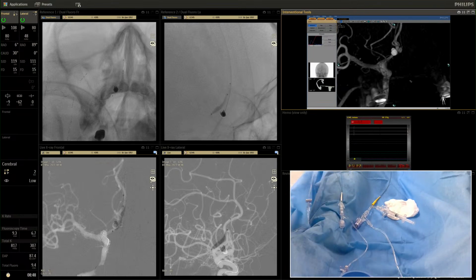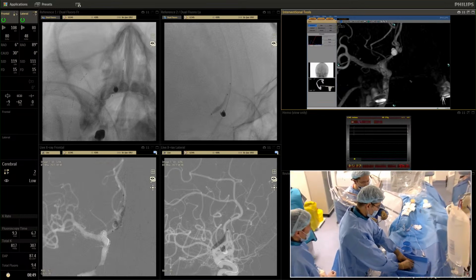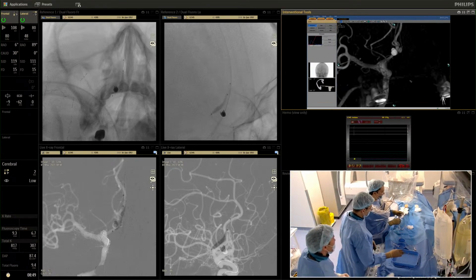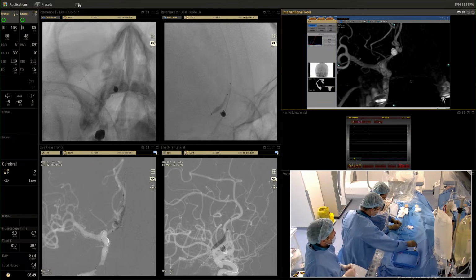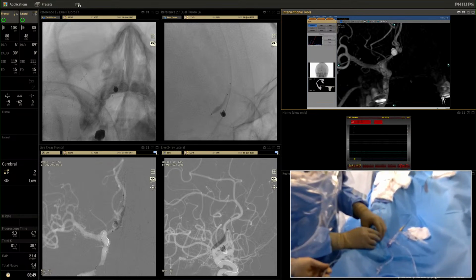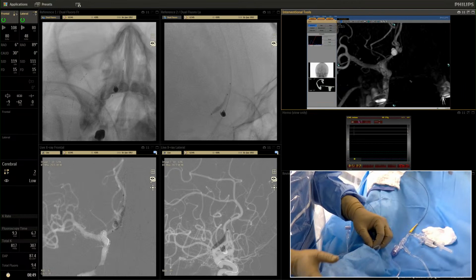Okay, Shahmet is asking to do control angiography super selectively. The name of this technique is aneurysmography, but it might be a bit risky because you may rupture the vessel, you may rupture the aneurysm. That's why we will do aneurysmography with the coil.